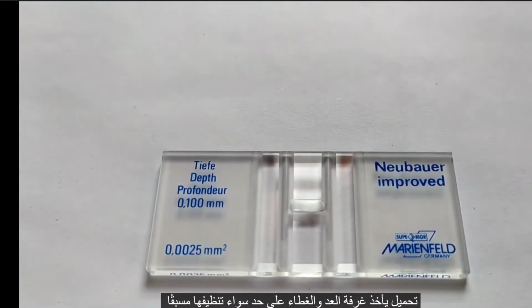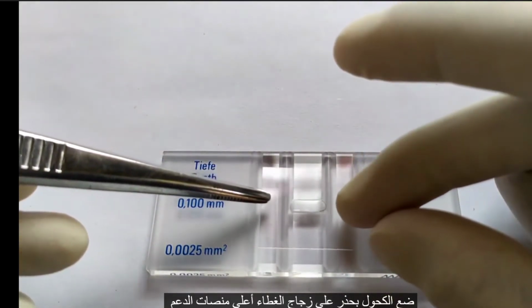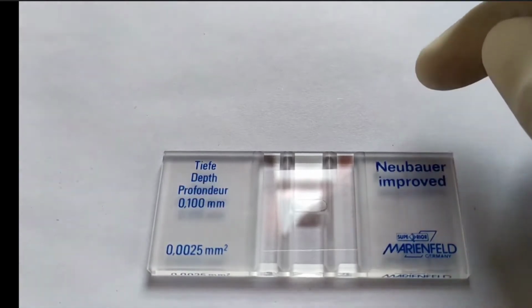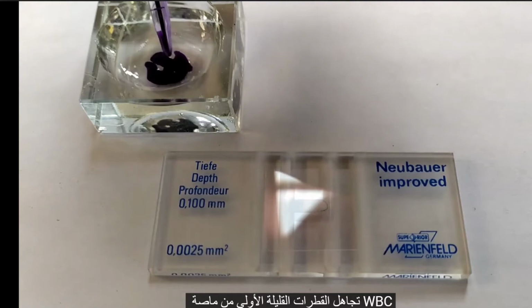Take the counting chamber and the cover slip, both pre-cleaned with alcohol. Carefully position the cover glass on top of the support platforms located on both sides of the counting chamber platforms. Discard the first few drops from the WBC pipette.